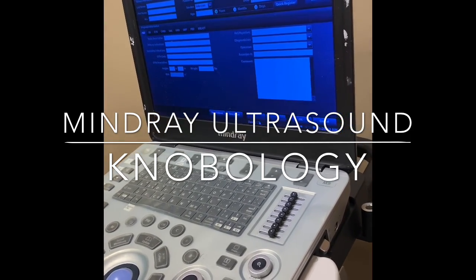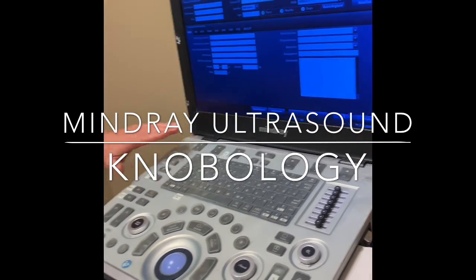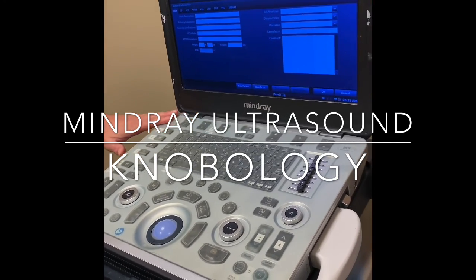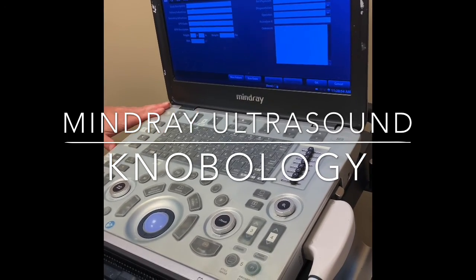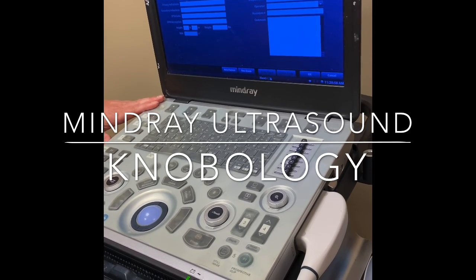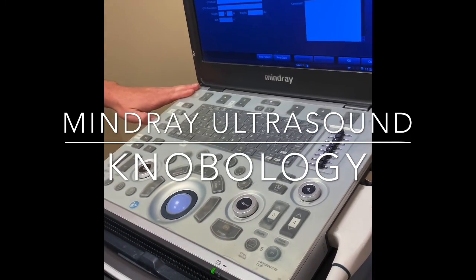Now, when you're done, avoid closing the lid of the machine or turning the machine off, because that will halt the transmission of images to QPath. It is okay to leave it open and turned on for the next provider. When you're done with the machine, please return it and plug it in.